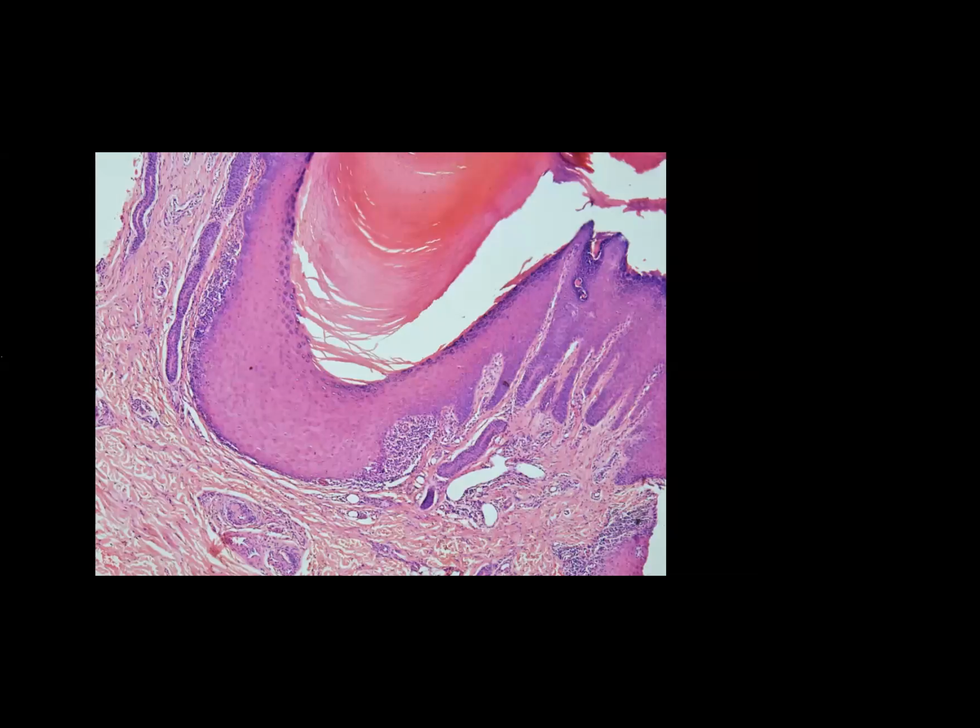Examination of the soles again showed multiple pitted papules and plaques on the sole with spillage onto the ankle. And when a biopsy was performed from one of these pitted papules, we could appreciate this parakeratotic invagination of the stratum corneum into the epidermis. The epidermis showed hypergranulosis, there was acanthosis, and one could see on both sides this focal band-like lichenoid lymphocytic infiltrate.